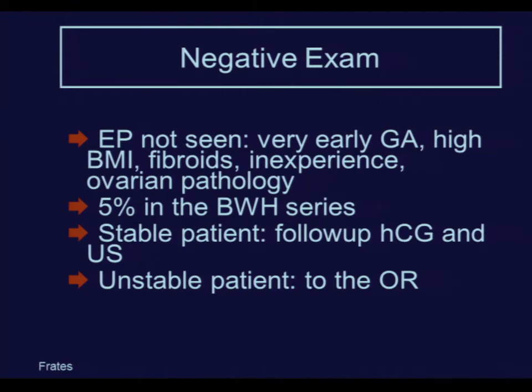What should you do with that patient? Well, if the patient is clinically stable, the most appropriate management is to follow the HCG and follow the ultrasound. Because at that point, with a negative exam, you do not know if you're dealing with an intrauterine pregnancy, normal or abnormal, or an ectopic. These patients should not be treated until the diagnosis is confirmed.